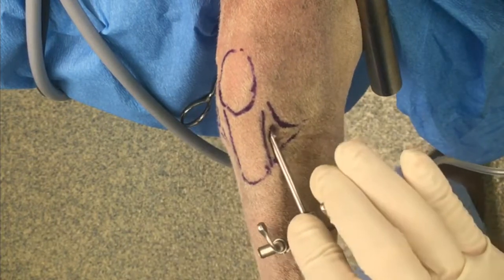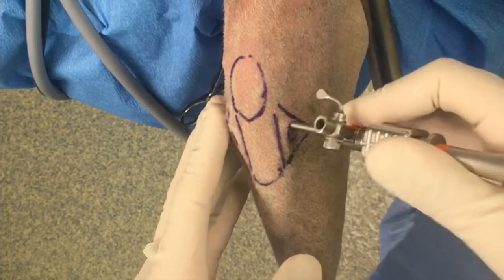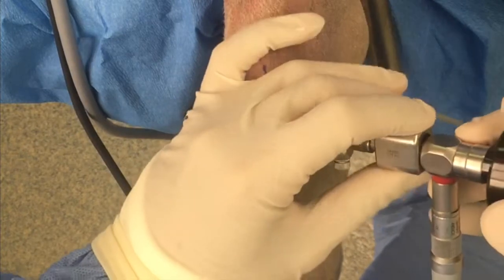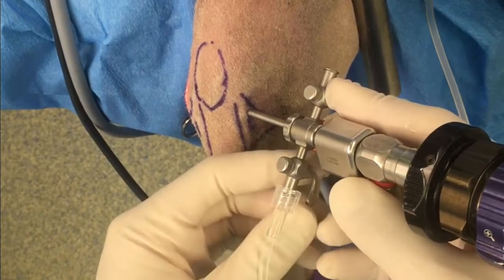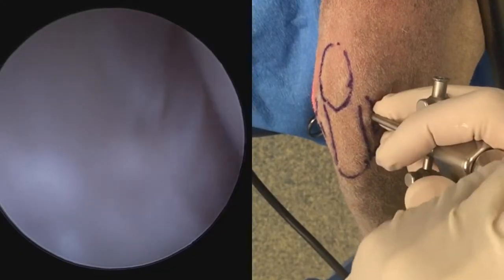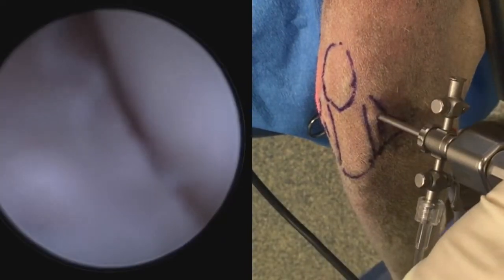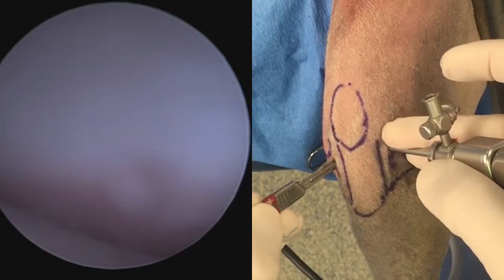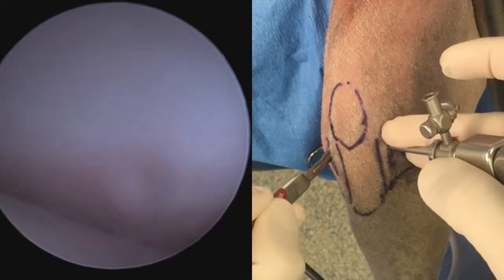The alternate home base is in the patellofemoral joint under the patella. My preferred method is the medial compartment. The obturator is removed and the arthroscope is placed within the cannula. Fluid flow is commenced and we are now able to start our exploration. When you start in the medial compartment, the first image will likely be of the medial joint capsule, in which case you have to back out slightly. Now we can establish our instrument port.